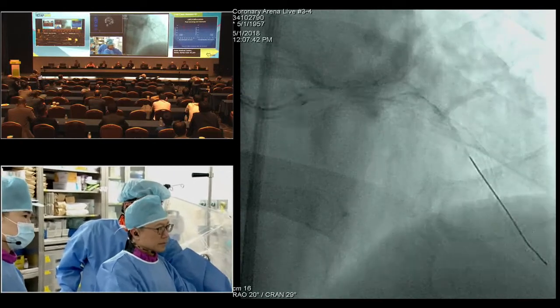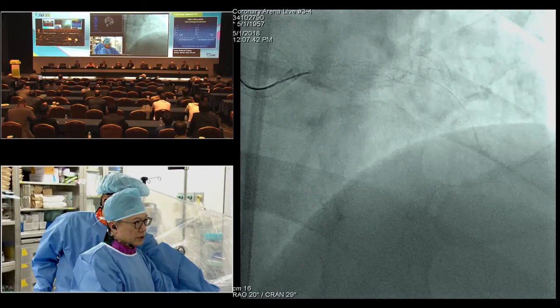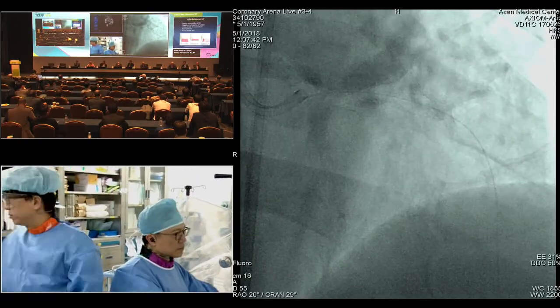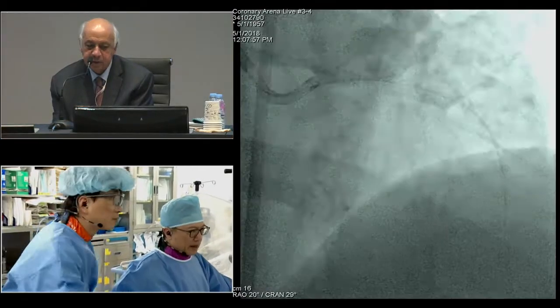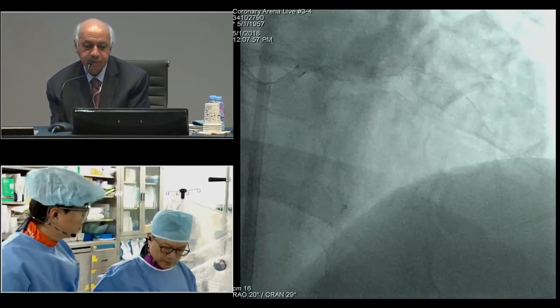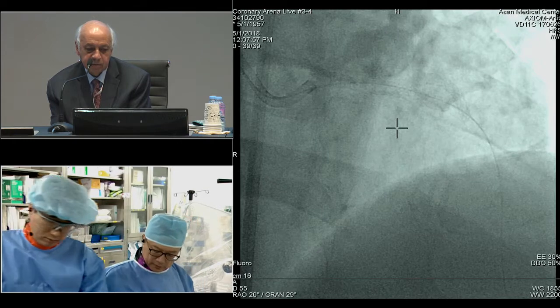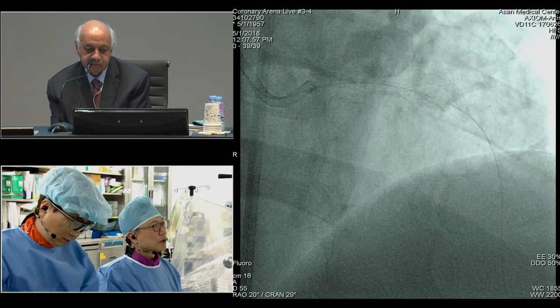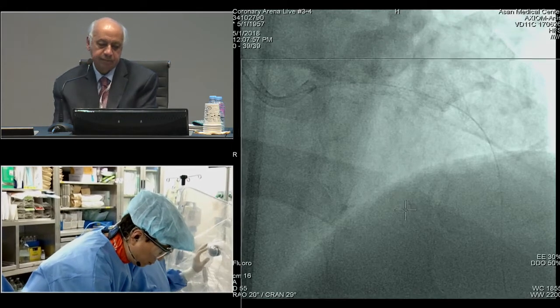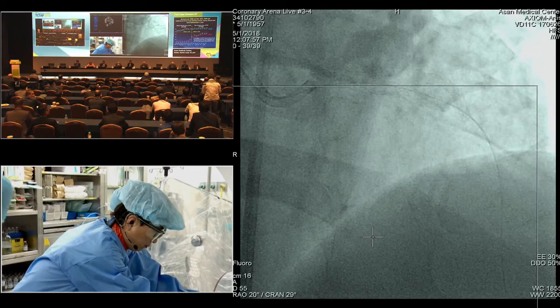Yeah. You said in the echo there is akinesia of the inferior wall, so are the circumflex and the two OMs so important rather than the right coronary? So we agree that it's very important to make complete revascularization of the CX, both the distal CX and all obtuse marginals, either now or in staged procedures after doing another thallium or a cardiac MRI. I think he had a non-STEMI. I'm not quite sure whether it was a STEMI.